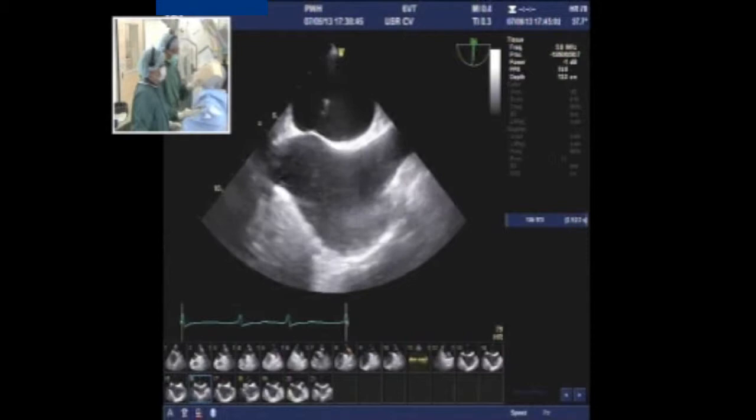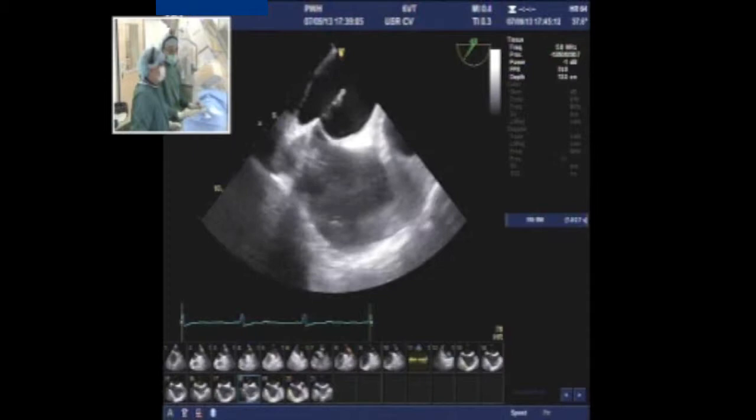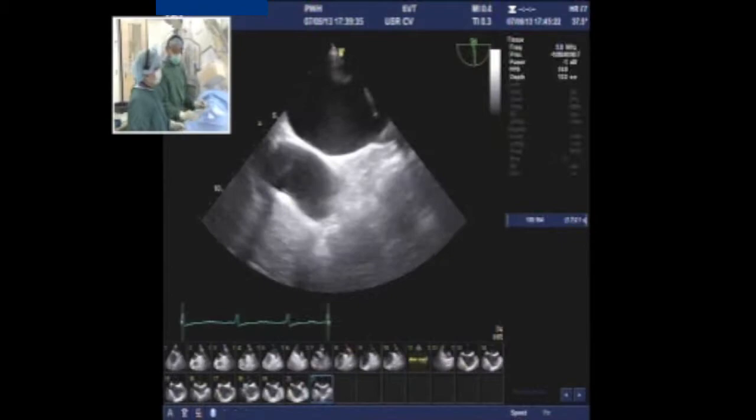We did the puncture, reached the left atrium, and directly through the SL1 catheter we pushed the Marker pigtail. When you have a good puncture in a good location, it typically goes directly into the appendage — and that was the case here. We have now reached the appendage with the Marker pigtail, which is a 5 French Marker pigtail.